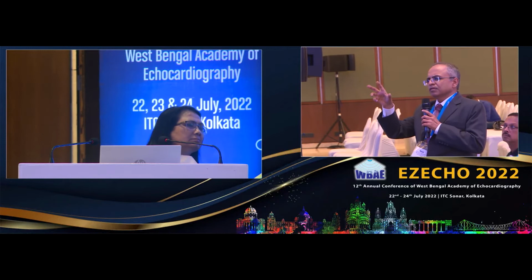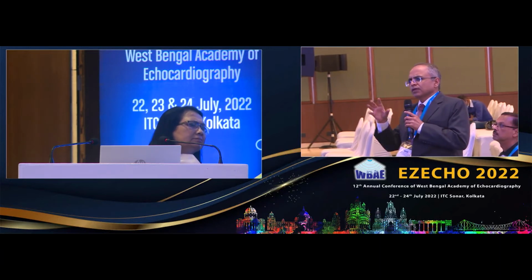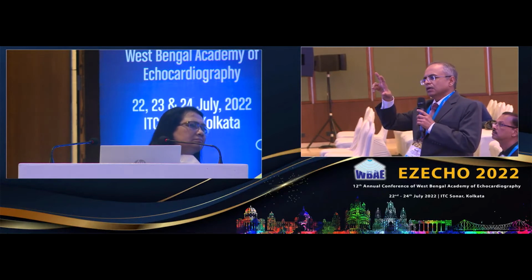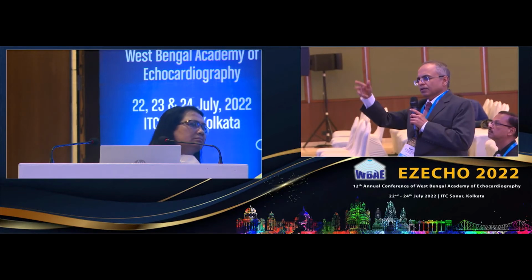So when was this MRI done? He came on the 4th day and on the 5th day we got it done. Correct. So that is the best time. The culprit vessel identification is one of the strongest qualities of MRI because of the edema imaging.